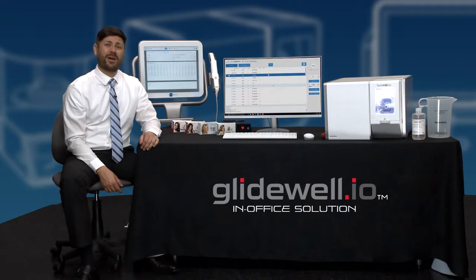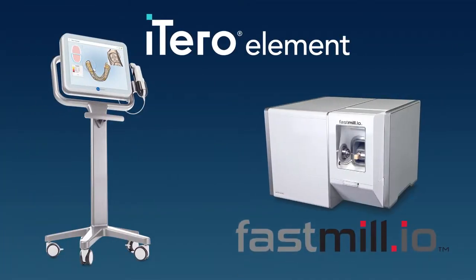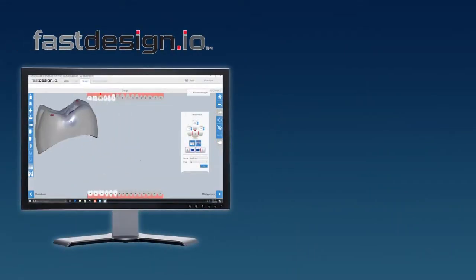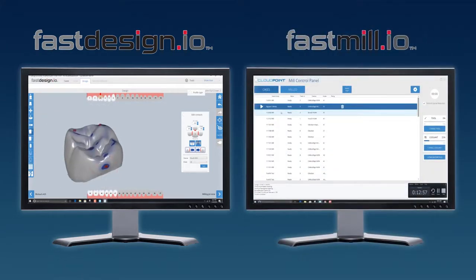The main elements of the Glidewell.io solution are the physical components that go into the doctor's practice, such as the iTero Element intraoral scanner and the FastMill.io in-office unit, and the intangible digital elements, such as the FastDesign software and the FastMill.io mill control panel.